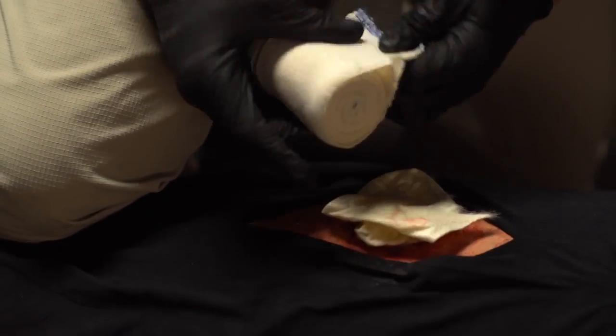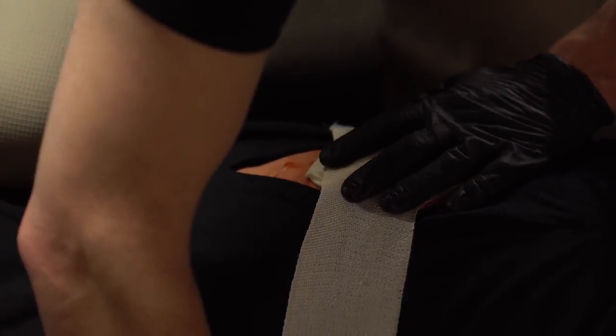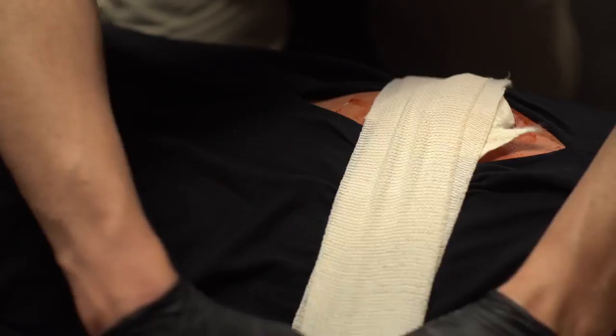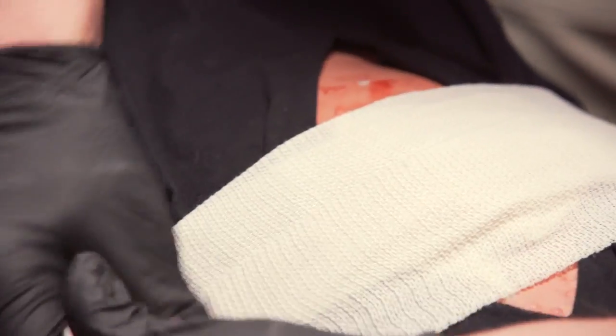If bleeding persists, attempt to add more packing if possible. Apply additional direct pressure for 3 more minutes and add a compression dressing. Should the bleeding continue, additional measures such as the Sam XT Extremity Tourniquet above the wound or a Sam Junctional Tourniquet may be needed. Apply until bleeding stops and expedite transfer to a definitive care facility.